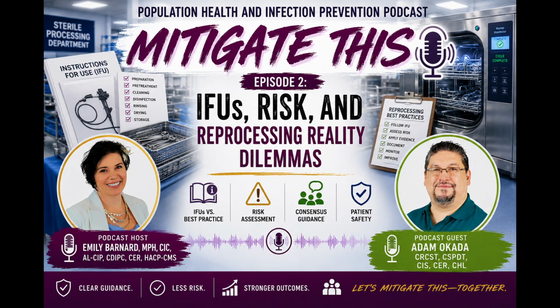after decontamination. Now, if you're not following those IFUs to the letter, then now the facility who is supposed to be verifying that they can do those instructions isn't actually doing what they're supposed to do. So I think a great tip for IPs going into sterile processing is really ask, what are you doing? And then why are you doing it that way? Because the answer should always be that's the way the IFU says.